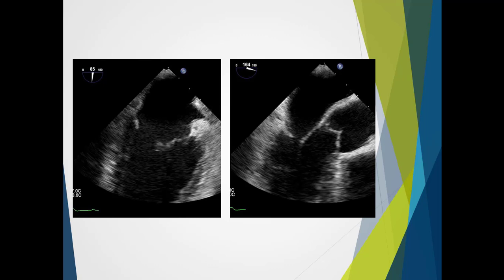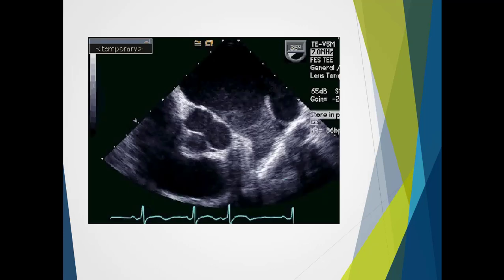Here we have assessment of the mitral valve with different rotations of the TOE probe — a two-chamber view and a long axis view. Here we've got a short axis TOE view, and we're actually looking at the left atrial appendage. We can see it is filled up with a lot of spontaneous echo contrast, which is a precursor to actually forming clot.